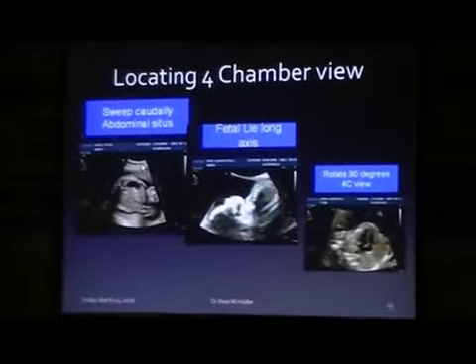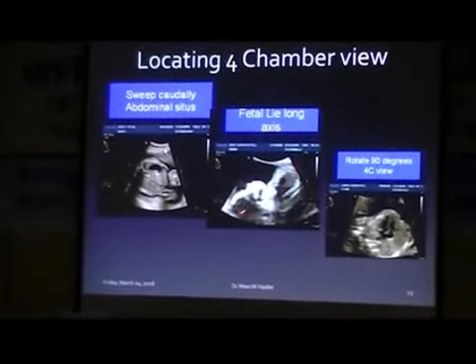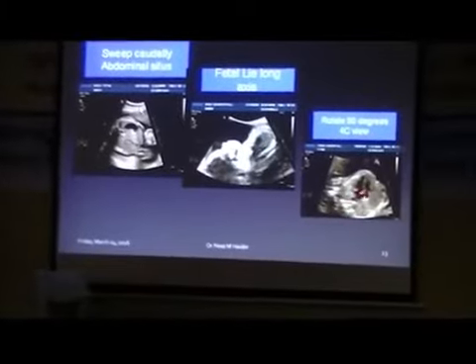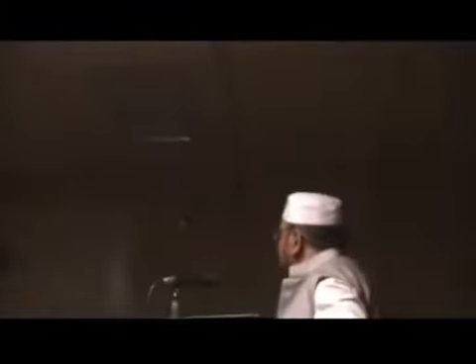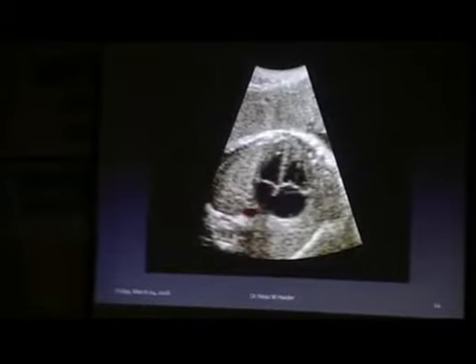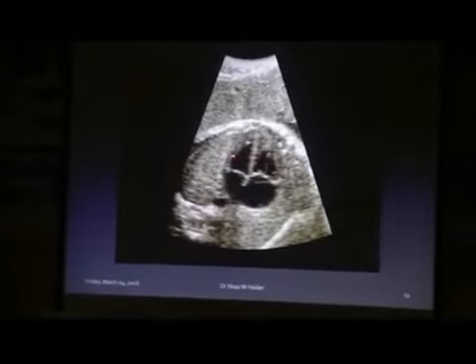From our abdominal circumference, this is the fetal lie in long axis, and if we proceed to the fetal head we will get the fetal four-chamber view. This is the four-chamber view, and this is the right ventricle, which is the most anterior chamber. This is the descending aorta, which is just close to the spine. From this side is the left side — left atrium, left ventricle, right ventricle, which also contains the moderator band — and this is the right atrium. This is the foramen ovale, and this is normal anatomy. Both the ventricles are of equal size, and both the atria are also of equal size.